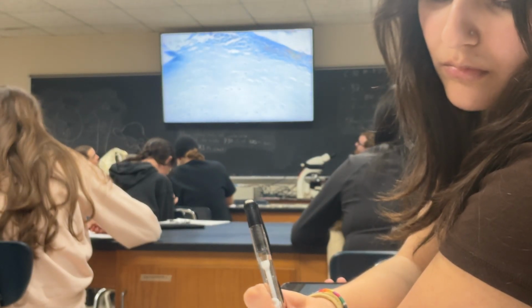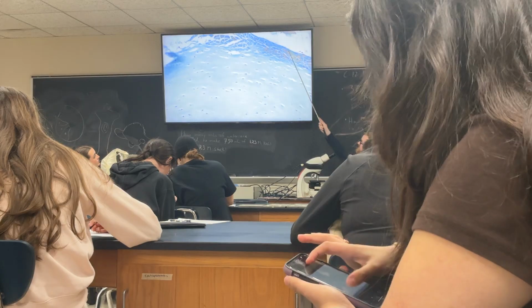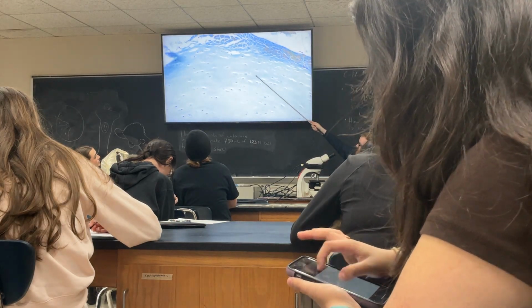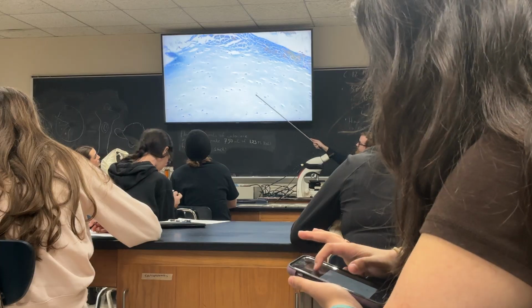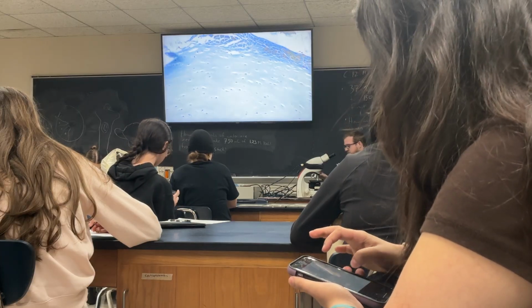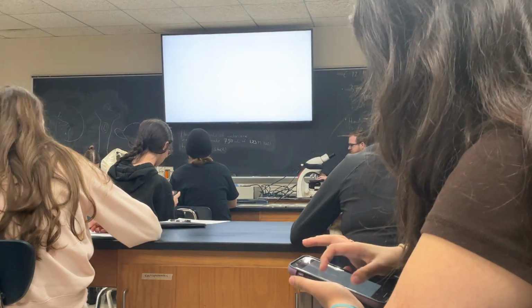Even out here is a really good view because it's just smooth in between. But you can see all these lacunae with the little nuclei inside of them. Alright, so outside of the cartilage, there's not too much to write home about for these cartilages. You just need to be able to tell the difference.